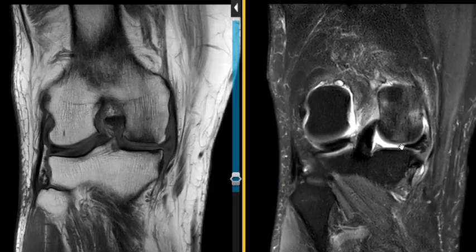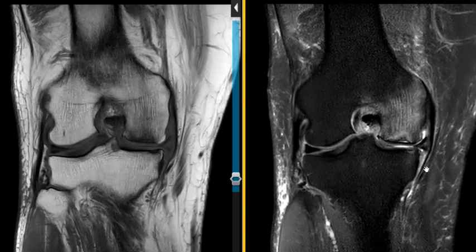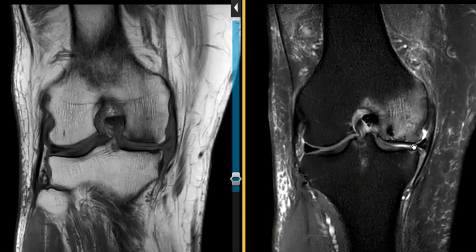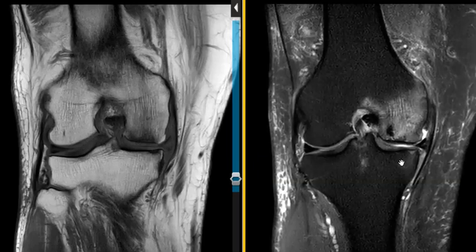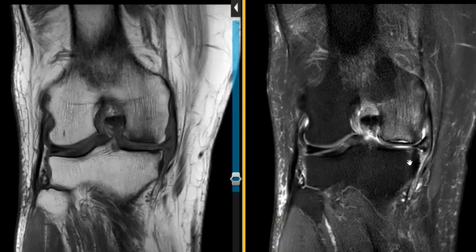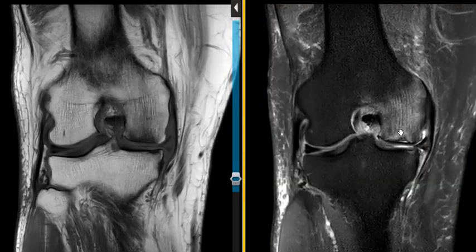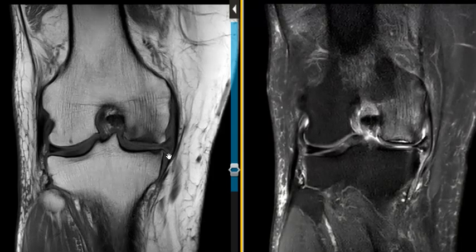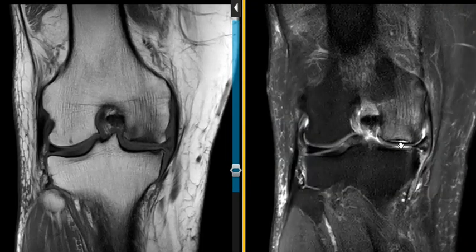When this is torn, again, the meniscus no longer is attached to the bone over here, and this can drift outwards. We call this pseudo-extrusion — it's just squirted out like toothpaste. You can see it's squirted out, and with this no longer acting as a shock absorber or cushion in here, we see that the femur and tibia contact one another. There's abnormal mechanics of stress, and there is abnormal marrow edema throughout the medial femoral condyle. The articular surface is relatively flat instead of rounded, and there's also a little band of fluid right beneath the cortex. This is what we call a stress fracture with early articular surface collapse.